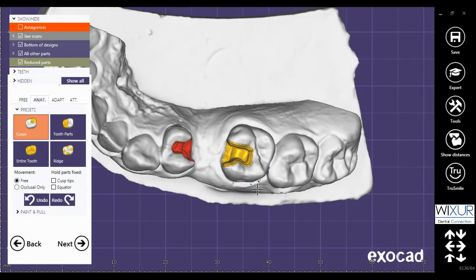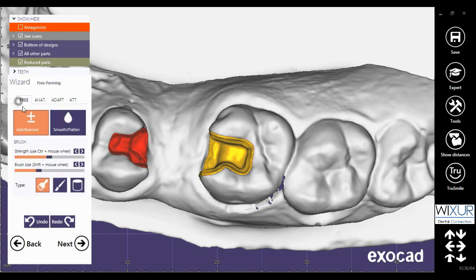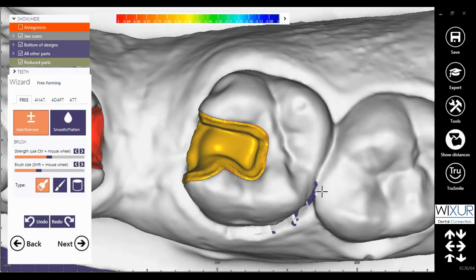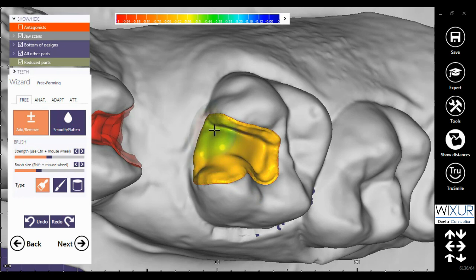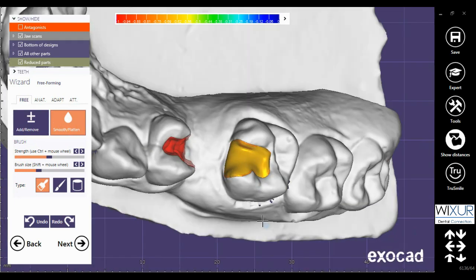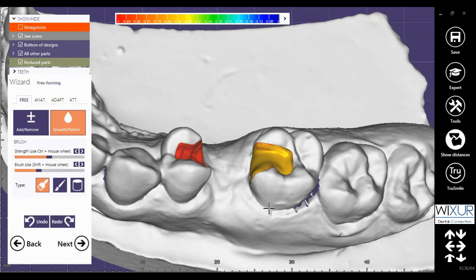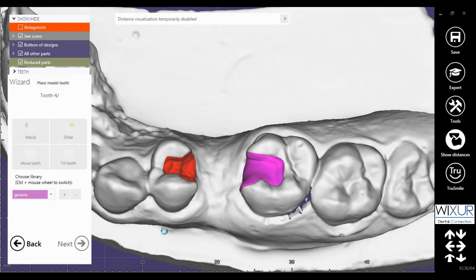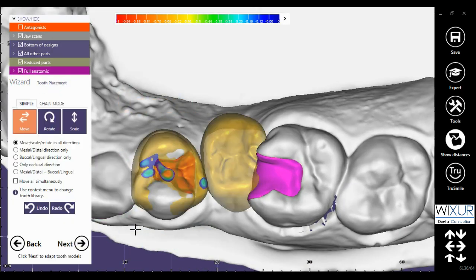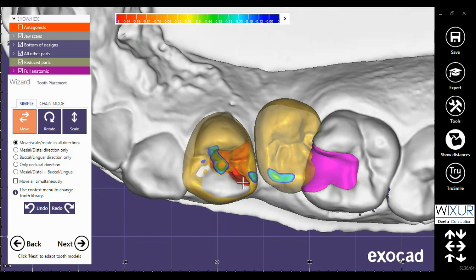Tooth number 6 needs some reforming. I use the show distance feature not to exceed the required height. Check the buccal and lingual side. Next. Now it's time to place the two pre-molars.